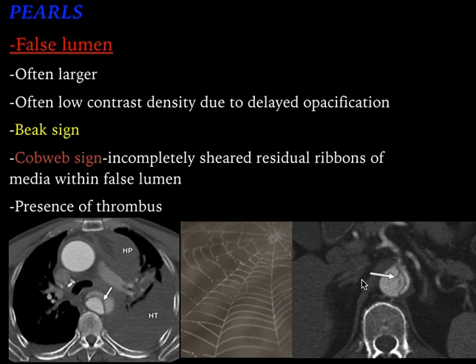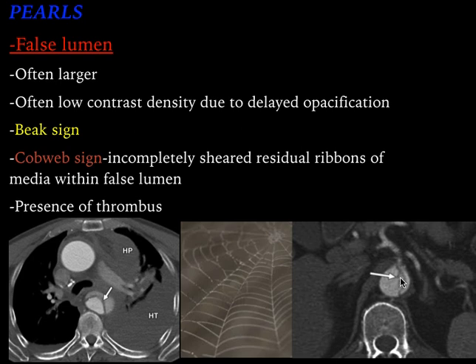Now let us see how to identify the false lumen. Usually the false lumen is larger in size, as you can see in these images. It often has low contrast density, which is due to delayed opacification of contrast. There is also the beak sign, the cobweb sign, and the presence of thrombus. The cobweb sign refers to hypodense strands within the false lumen hanging from the displaced intimal layer — these are residual ribbons of the media. The presence of these strands, resembling a cobweb, helps in identification of the false lumen.